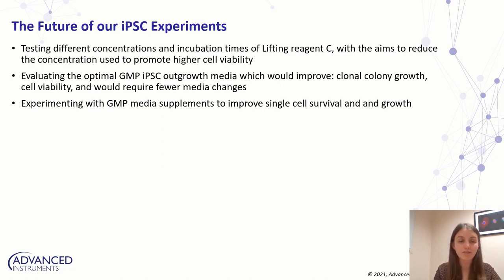We also aim to evaluate different GMP iPSC outgrowth medias, which could improve the colony growth and cell viability, and we can investigate the potential for weekend-free media changes. Finally, we aim to experiment with different GMP media supplements to improve single-cell survival and colony growth.